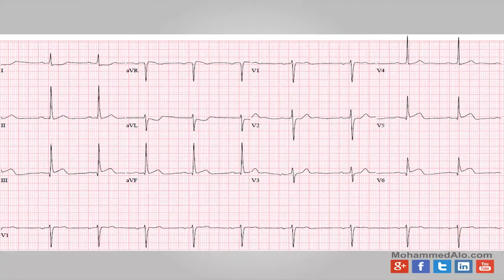Next EKG, you got ST elevations in lead 3 only almost. Well, it's kind of subtle. But here you have an ST depression in AVL. Remember I told you ischemia does not localize. You can't just say the patient has lateral ischemia. That doesn't happen. There's no such thing. If you have ischemia, V5 will be depressed and lead 2 will be depressed, not just AVL. So if AVL is depressed, you got to think this is probably a reciprocal change for an actual STEMI somewhere. So where's the STEMI? What reciprocates to AVL?